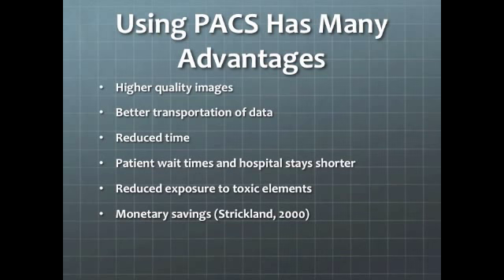These savings come from purchasing films, the chemicals to process the films, the film jackets and packets, and the salary of the staff that would be needed to process the film. Also on the film-based equipment, the film storage space, handling costs, and transcription costs.